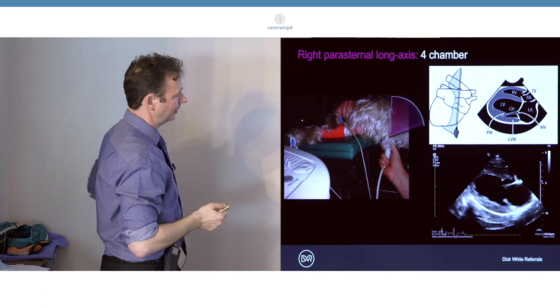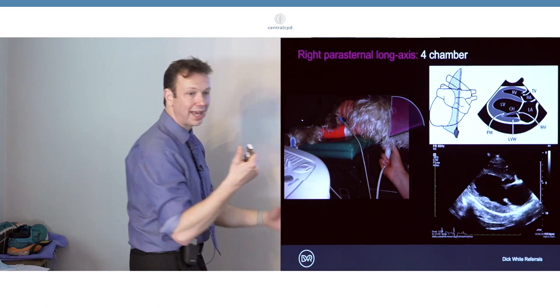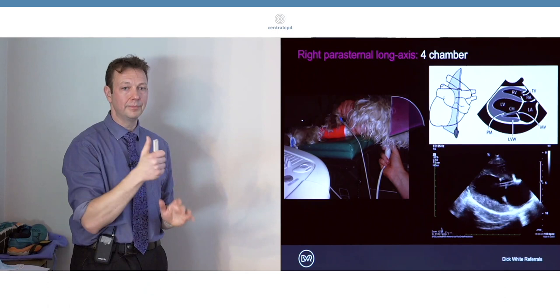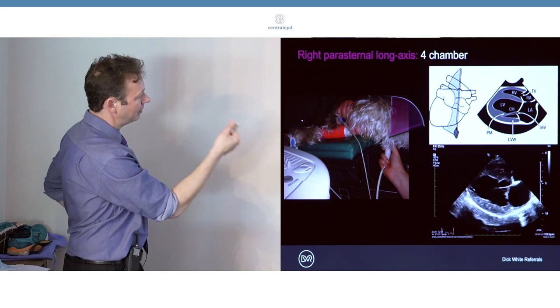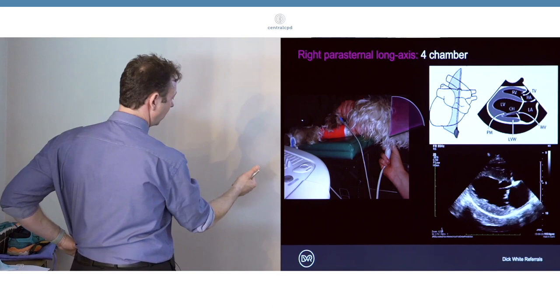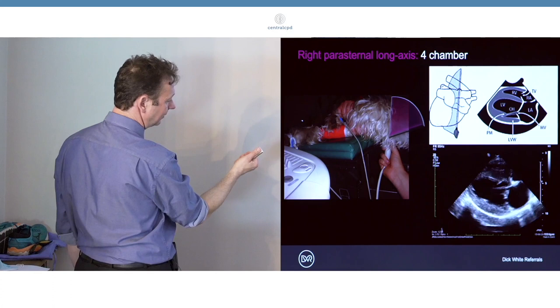When holding our probe, if I've got my back to you and the patient's here, I'll be holding the probe with the thumb. All ultrasound probes have a reference mark on them which is usually a groove or maybe a ridge. Use that reference mark and put your thumb on that - that will help guide you as to your movements of your wrist and thumb. With our four chamber right parasternal long axis view, we're holding our thumb on the transducer mark and we're having our thumb pointing slightly towards us. The thumb tip and the transducer face are pointing upwards and towards the animal's lumbar spine.